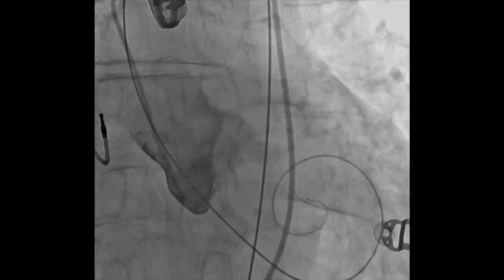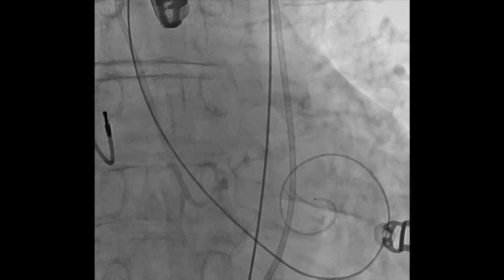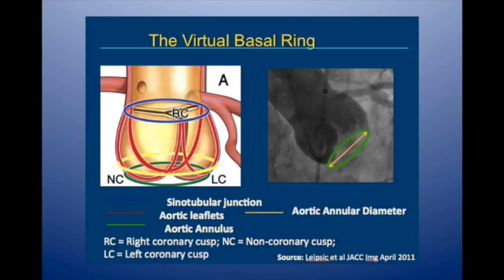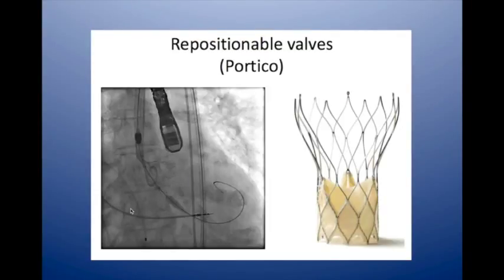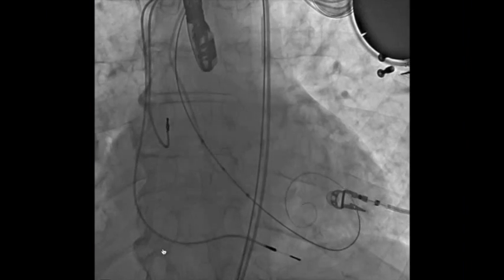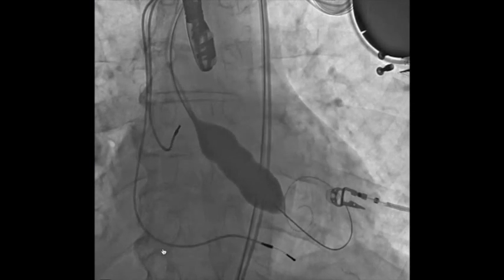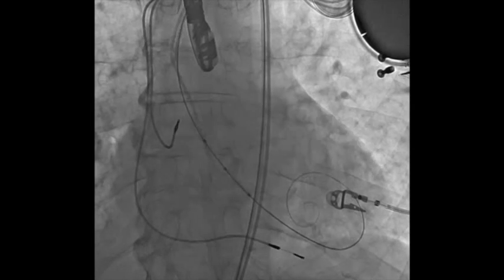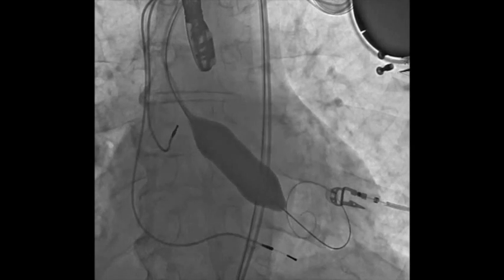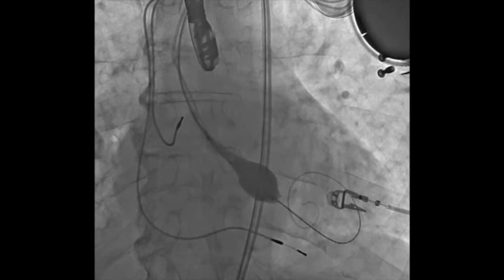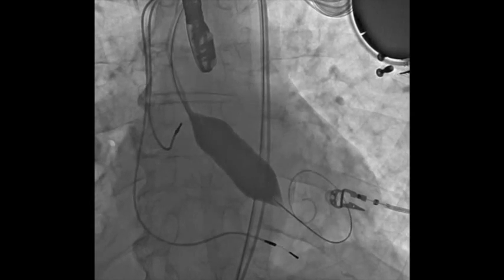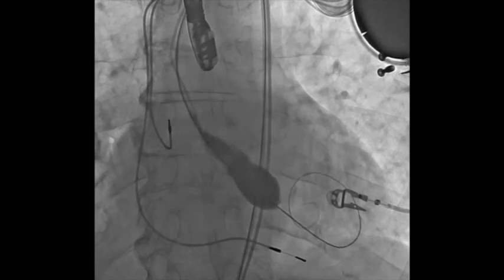The procedure we're about to show used a Portico valve. It has a very straight bottom — the LVOT part of the valve is straight, not flared like the CoreValve, and it's quite long unlike the Edwards valve. Here we're doing a balloon valvuloplasty — which is why we need to know how much aortic regurgitation there is beforehand, because it's likely to get slightly worse after the balloon. You need to have the TAVI valve ready so you can put it in straight away should you get severe AR.